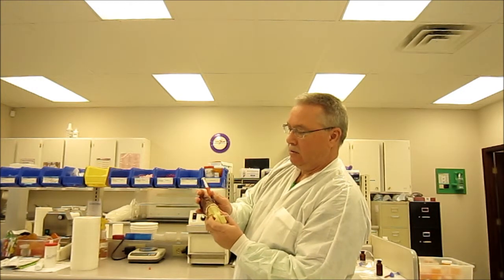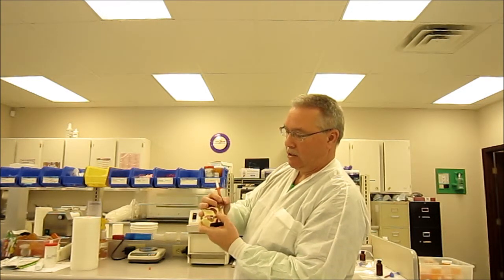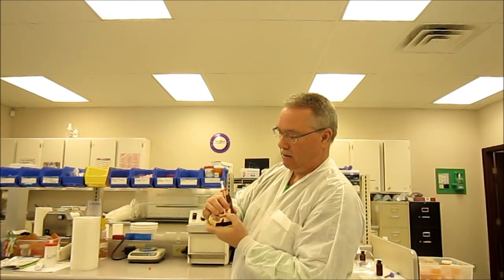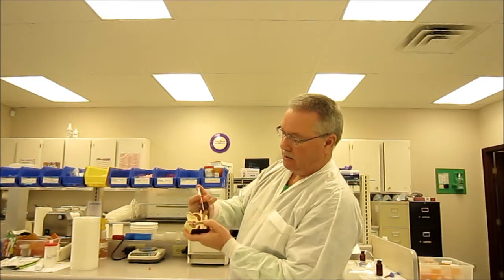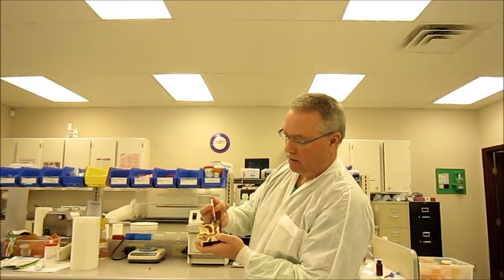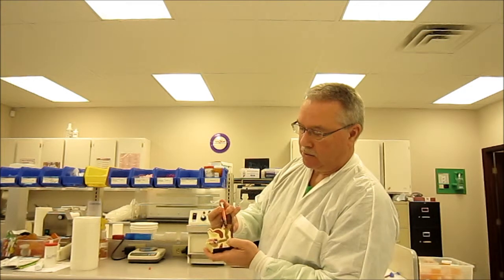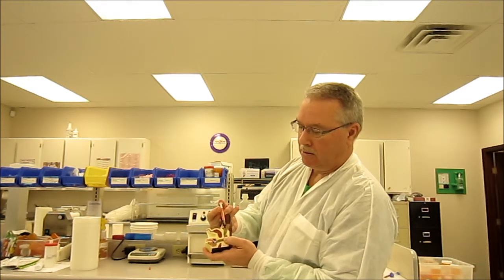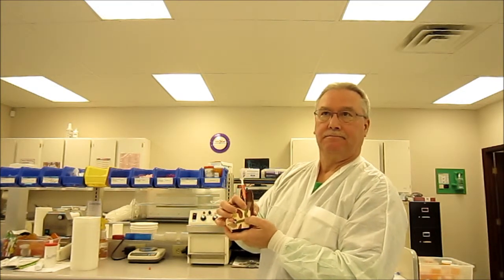So what the vet is really doing is dropping that syringe down into the upper part of the canal, and then as that lays in there, they're just pushing that gel down into the canal. And they just gently push that until they either get some resistance or they get a backfill out, and then you've got the canal filled with your medication. Okay?